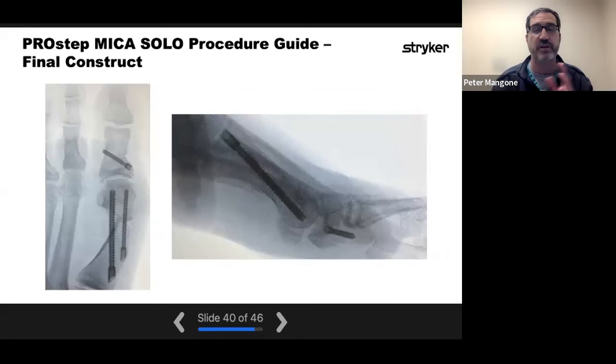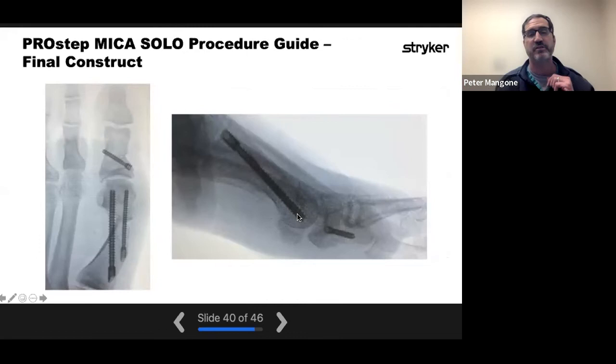Another example of the final construct — with the sharp corner removed and a little bit of medial eminence taken off as well. You can see the screws trajecting into the metatarsal head down through the shaft. In this particular case the patient had a little more cavus foot, so I started with a slightly higher trajectory. One thing to be aware of: if the guide falls down into the arch as you tighten the screw-jack mechanism, your starting points end up too low. The foot is more full dorsally than plantarly, so the tendency is for the guide to rotate downward slightly.